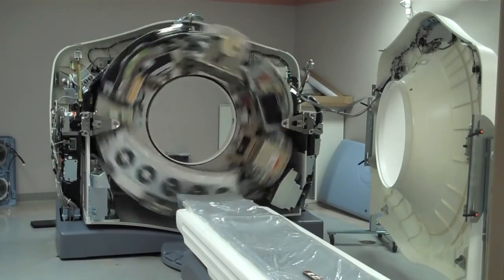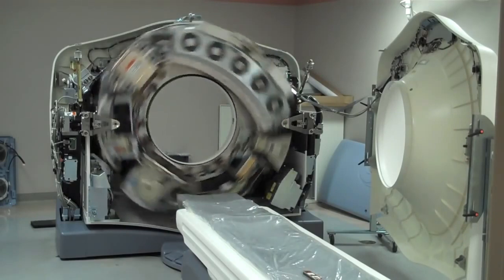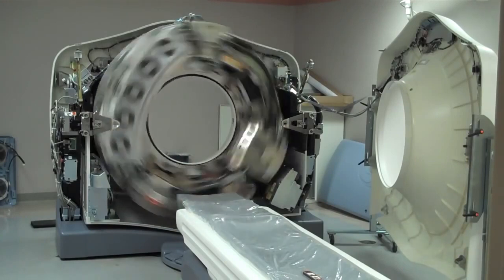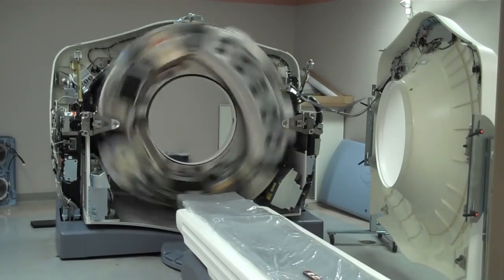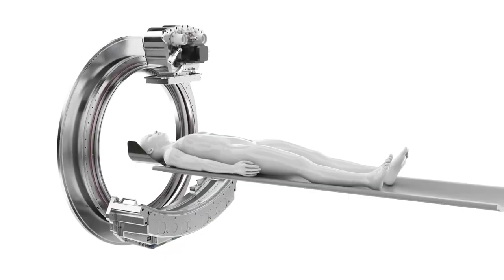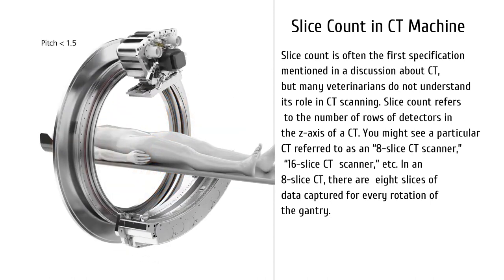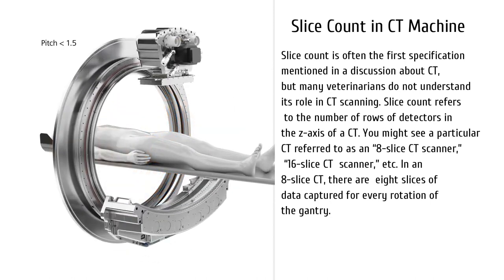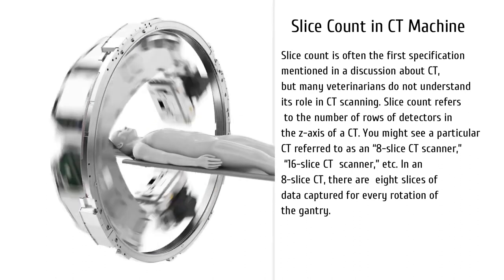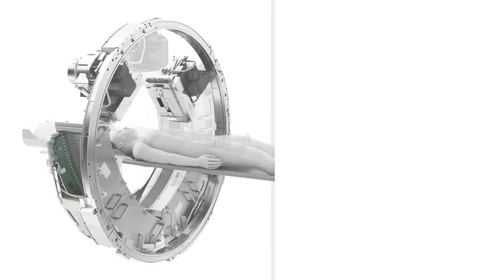16-slice CT machines can perform a wide variety of sophisticated and complex imaging procedures. It provides full organ coverage with high-resolution imaging, but is not considered adequate for detailed cardiac analysis such as coronary vessel analysis. 32 to 40 slice CT machines generally feature shorter examination times than the 16 slice, with reduced likelihood of motion artifacts.